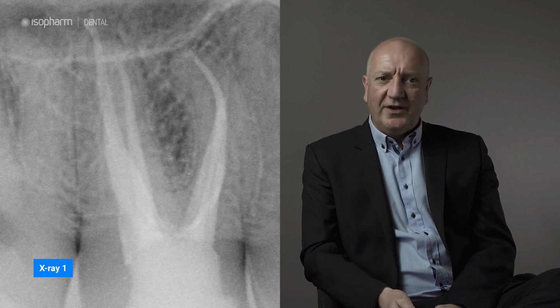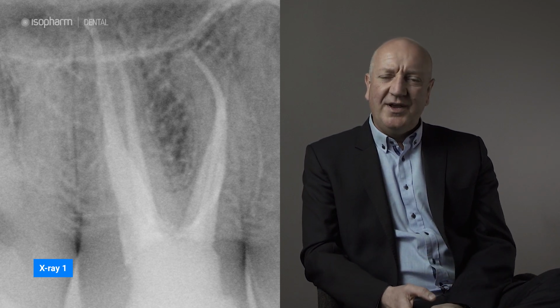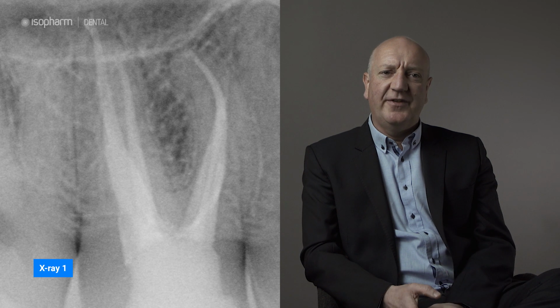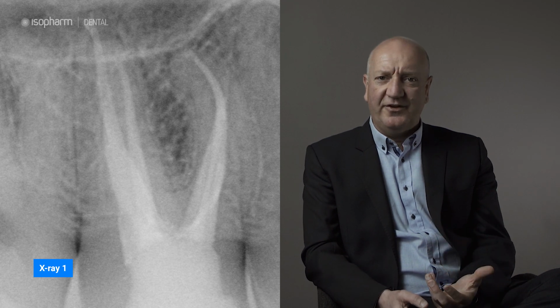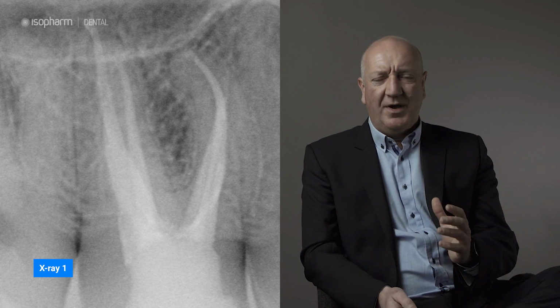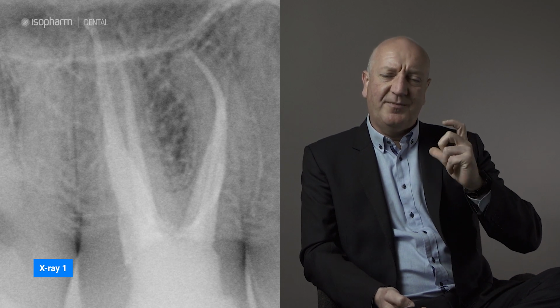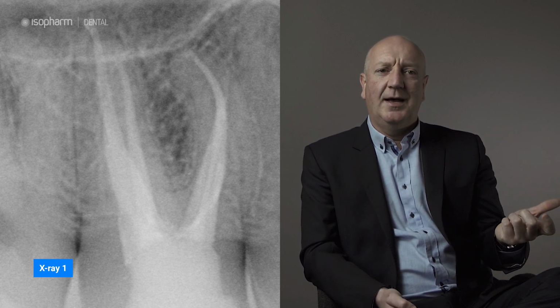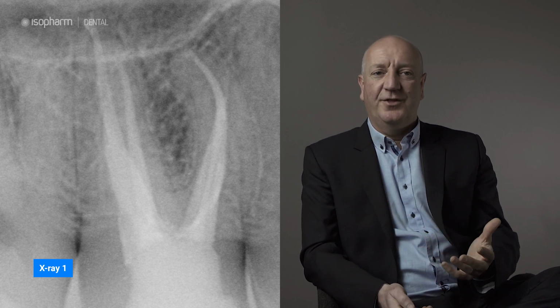This is the first X-ray that we took when we first saw the patient, and that confirms that there's a great looking root canal, very little in the way of apical pathology. There aren't many clues on this X-ray as to what is going on. Now, rather than resort to a CBCT or opening the tooth up and exploring for root fractures or adjusting the occlusion, my first step, whenever I've got a patient where there's a conflict between the periapical view and the patient's symptoms, is simply to take another X-ray.